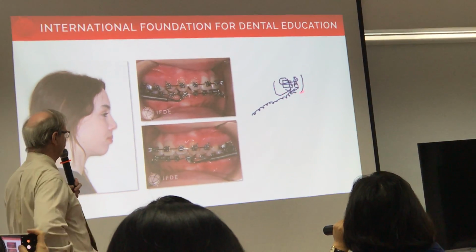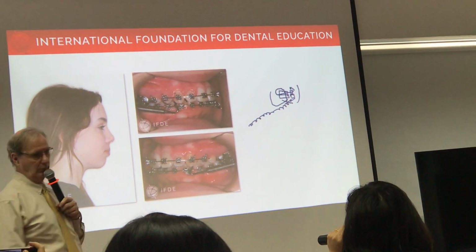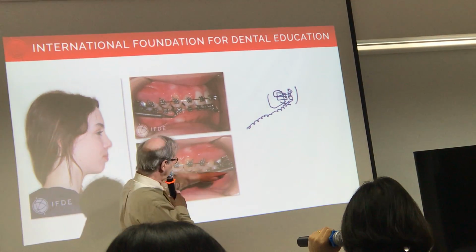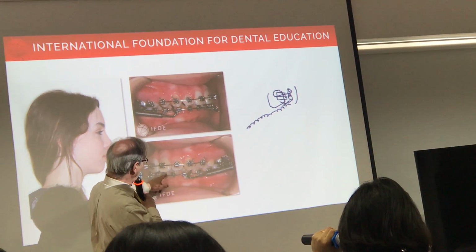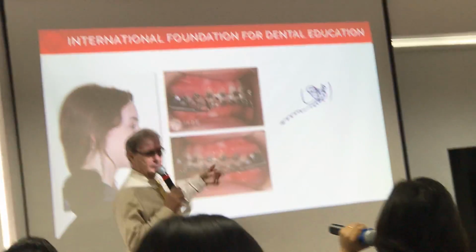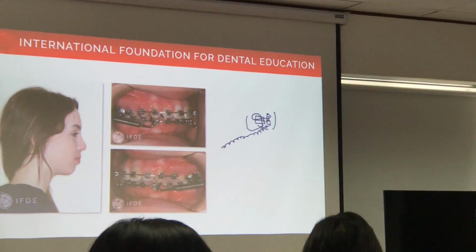I don't know about this because I just think that it is fixed distal. No, you just loosen it. Yes. But what it does is it's better forward, but the problem is you can't leave it on this patient too long because the incisors are going to come forward. Okay? Alright.